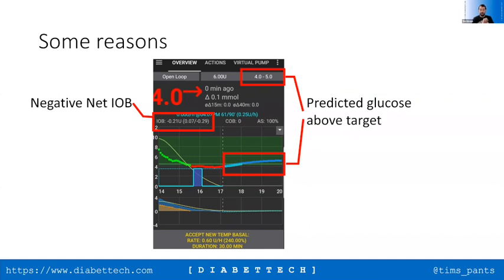And the bolus calculator is not using the algorithm that Android APS uses, which is the other key point in that. The net IOB is a consequence of the decisions the algorithm has made, but the key thing that drives whether the system thinks you need more insulin is the predictions that it is making. And therefore, if somebody says, oh, it's your negative IOB, therefore it must want to give you more insulin, that simply isn't the case. It's the prediction that drives the insulin delivery requirement, not the net IOB being negative. And as David says, the bolus calculator does not use the OREF1 algorithm in order to determine how much insulin you are delivering with a meal. So the two things are actually separate. So does anybody want to raise anything on this?